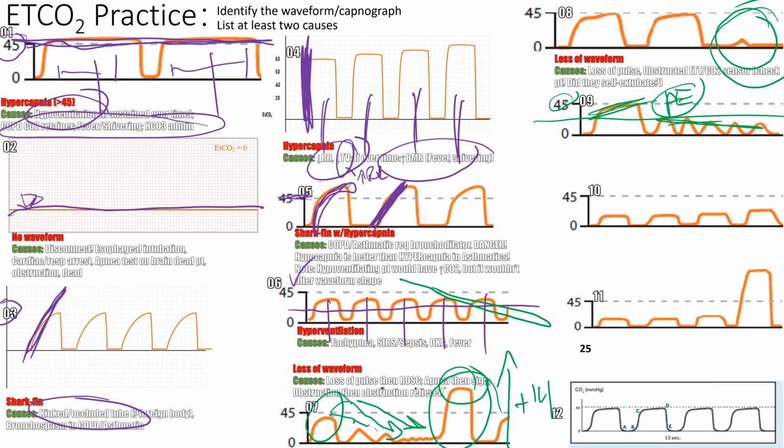Okay, so I think it's definitely more cardiac output, right? Unless all of a sudden they started breathing fast. It doesn't really make much sense. Why were they breathing fine before and now they're breathing really quick? Okay, so an obstructive pattern. It dropped right away. So yeah, it does look a little shark finny, but the immediate drop in cardiac output is what we're leaning more towards.